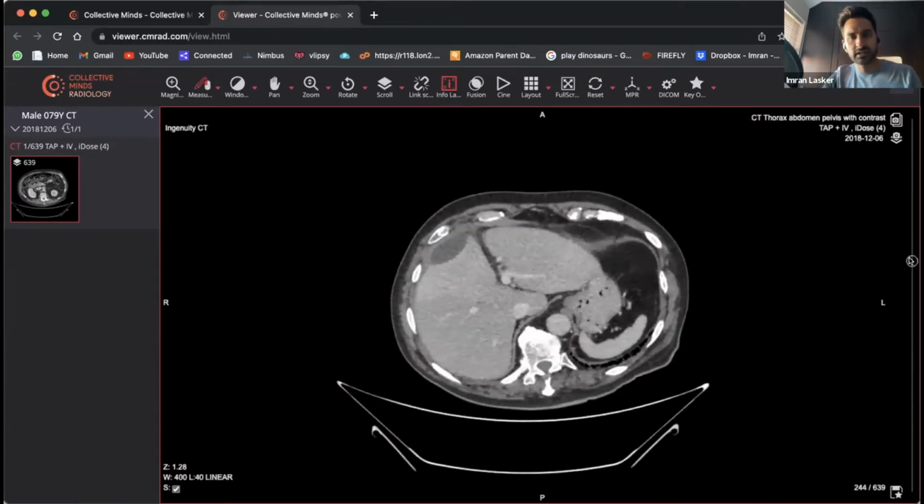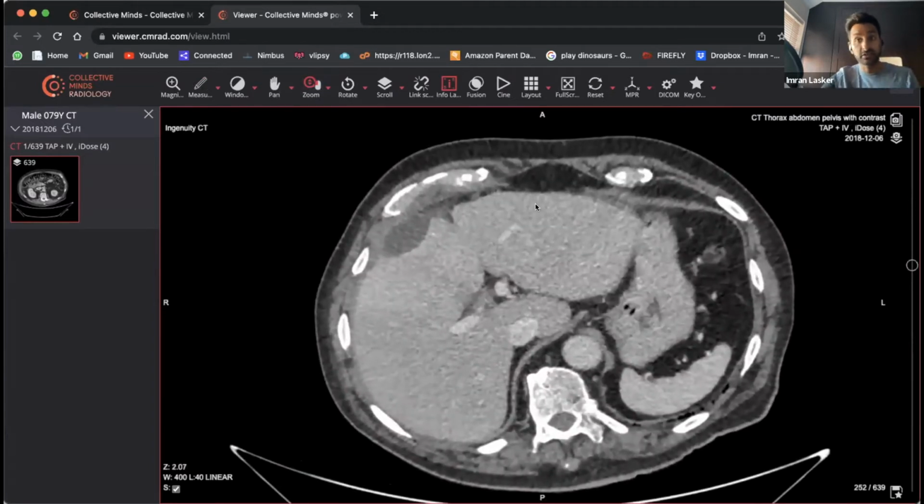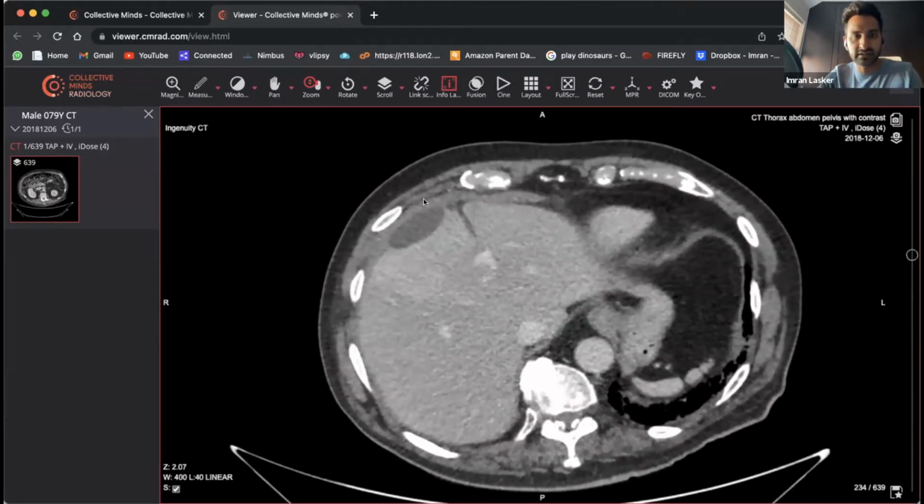And that's not normal. And then you've got to try and look at that and see whether it actually continues with the gallbladder. I mean, maybe it could be the gallbladder just continuing its way forward. So what we've got to do is make sure whether it connects or doesn't connect. There's a very, very important distinction to make. So if you keep your eyes there, what we might see is that either it's going to close off and then you're going to get gallbladder, or this is going to just continue to be the gallbladder.